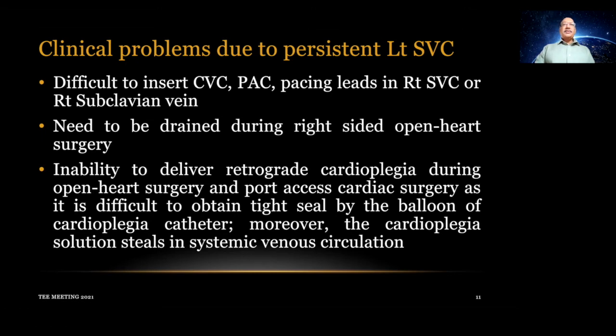Therefore, the left SVC has to be drained. So the majority of surgeons drain the left SVC either through the coronary sinus, or they put in a separate drain into the left SVC, the way the right SVC is cannulated. However, if the bridging vein, that means the left innominate vein or left brachiocephalic vein, is present, and the left SVC is joining the right SVC through the innominate, in that case, it is not always necessary to drain.